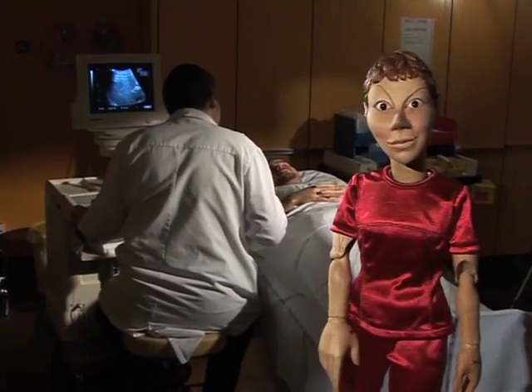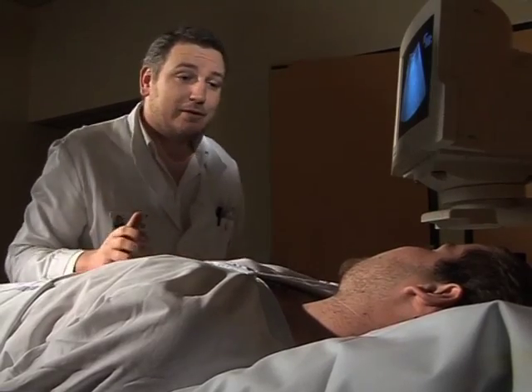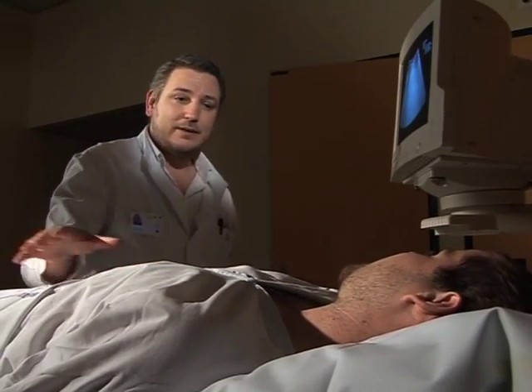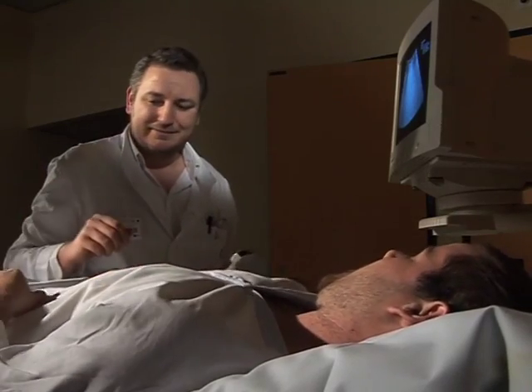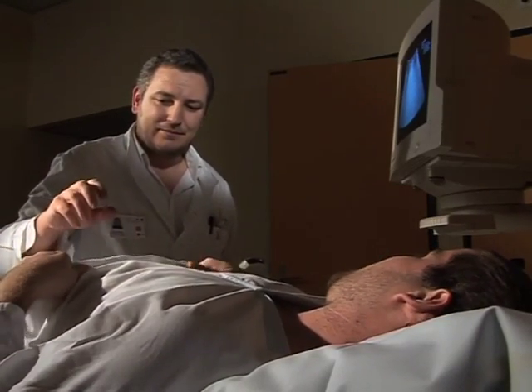This is the scan room. Hello, Mr. Chapuis. We're going to start now. Can you please lower the sheet, lift your gown and uncover your abdomen? Will it hurt? No, don't worry about that.